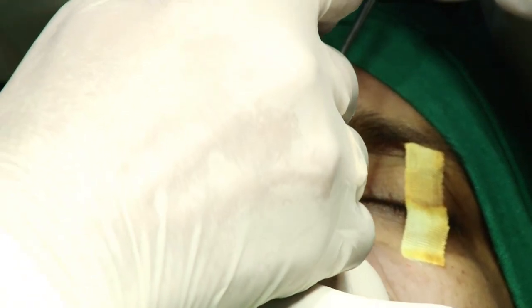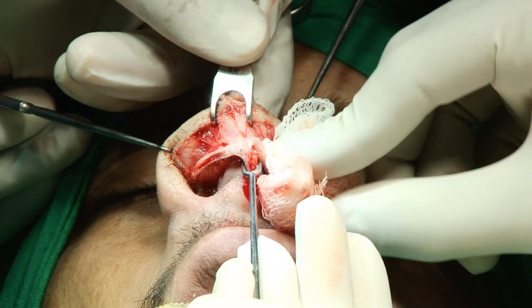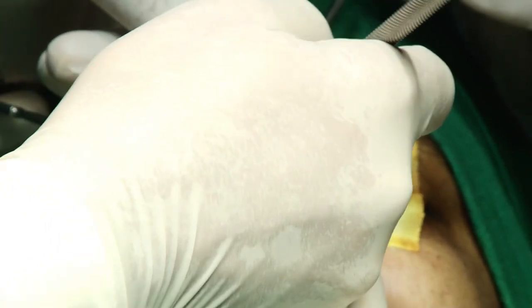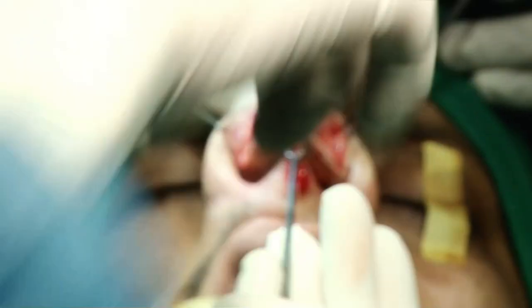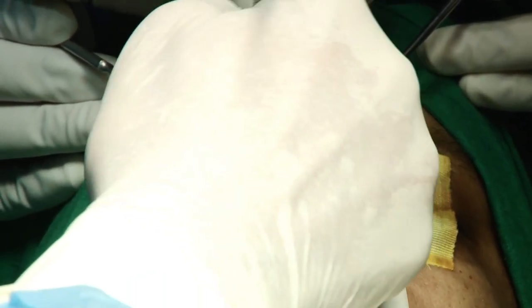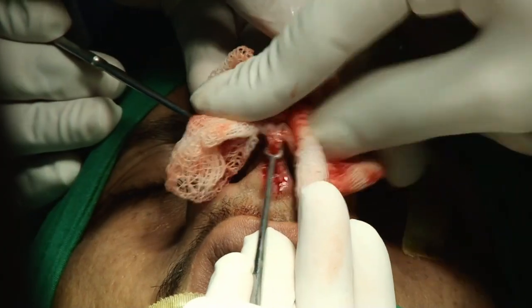My dissection is the supraperichondrial. I just clear this, a little bit of tension. So the plane of dissection, like we discussed this morning, is the supraperichondrial, and on this side for getting the plane, you make a tunnel on this lateral crus. Like this again, you just cross this. So you find your ideal plane. But counter traction is really important.